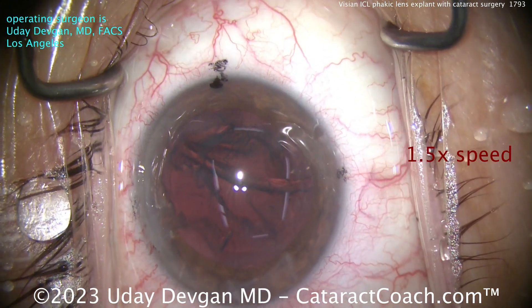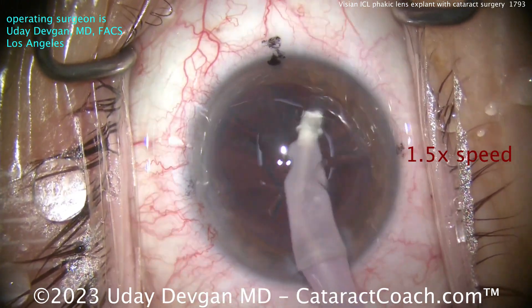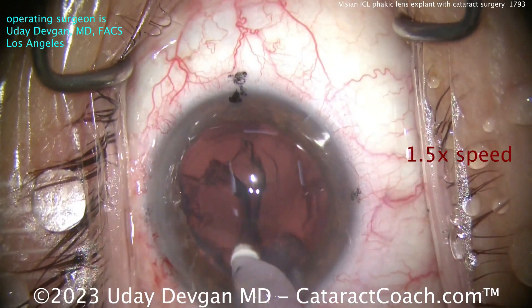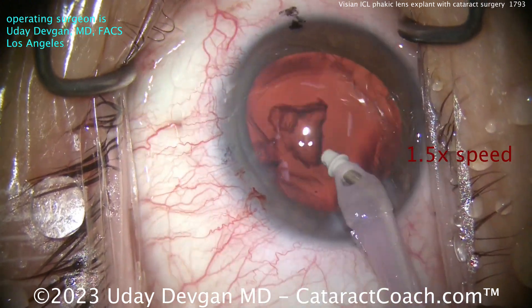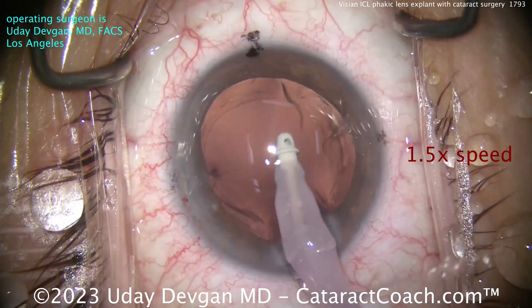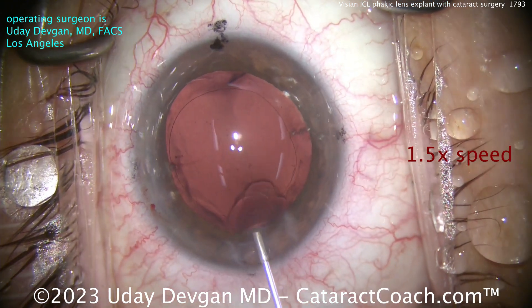The nucleus was relatively soft — we aspirate it out very easily. Now time for cortex removal. Do keep in mind we have a wider than typical phaco incision, so I have the purple sleeve, which is the 2.8 millimeter sleeve on our IA probe. We also have the same sleeve on our phaco probe. Don't use that tiny sleeve for a 2.2 incision when you have a 2.8 incision, because then you'll have AC instability, and the problem there is you may get even a ruptured posterior capsule.